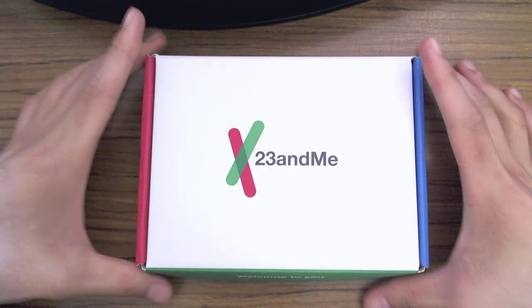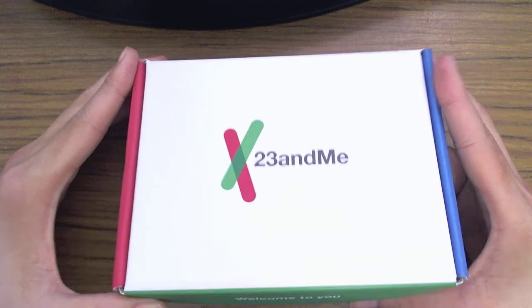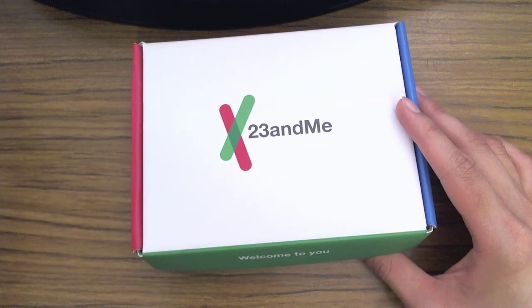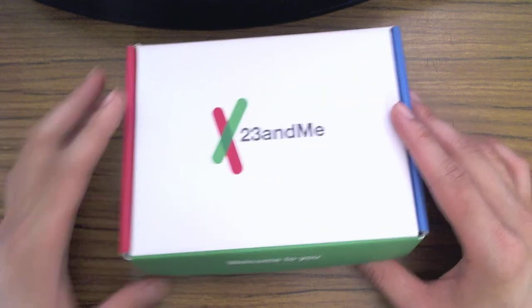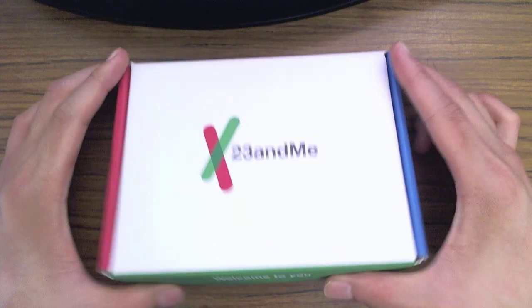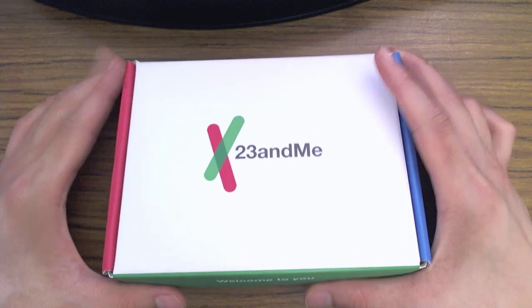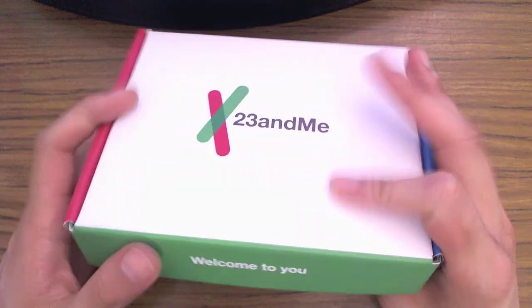What's up guys? I've just received my 23andMe genome kit that I ordered online today. What I'm going to do in this video is walk you through how you can set up an account and also an unboxing of this box.